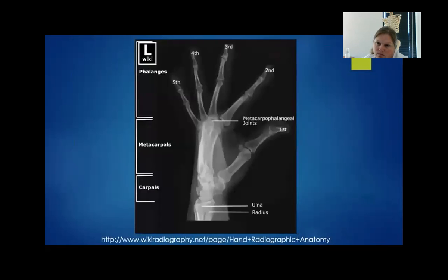And then we have our fan lateral. This one is clipping the top of the third. So we have all of the fingers spread out so you can see them. All of the metacarpals are on top of each other. And that lets us know we have a good position of the hand for the lateral. If it's leaning backwards or forwards, those metacarpals are going to be spread out where you'll be able to see individual metacarpals. The thumb is usually in like an AP looking position here because it's flat towards the IR.